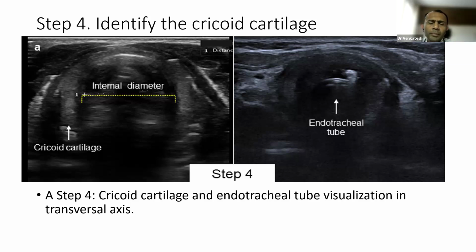One contraindication is pediatric age less than 14 for percutaneous tracheostomy in the literature. That's what it says. We all practice on adults, no, sir. I think it's always risky, especially in a very small patient. But in the intermediate age group, sometimes if the trachea is well developed, we have managed to get in a 6 size or 7 size sometimes. We have been intermittently doing tracheostomy. Of late, I have not done a pediatric one.